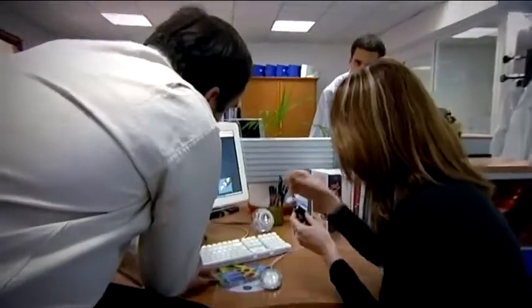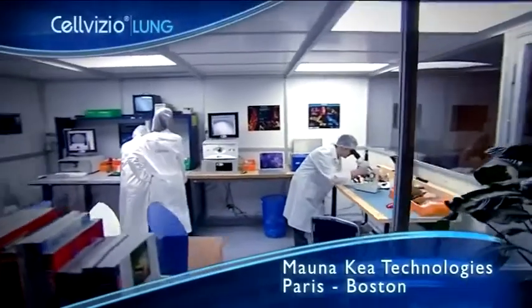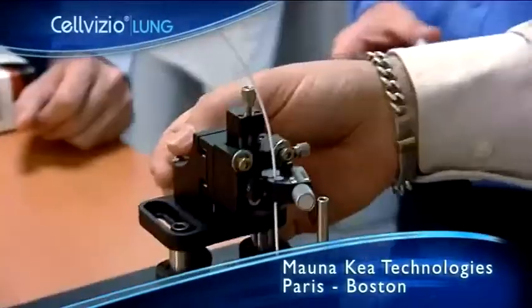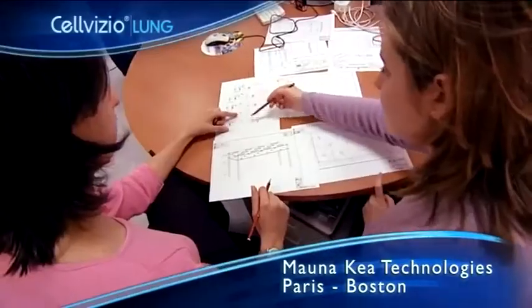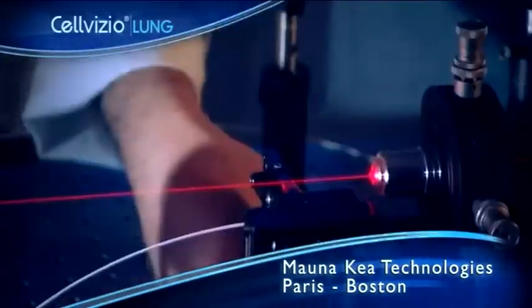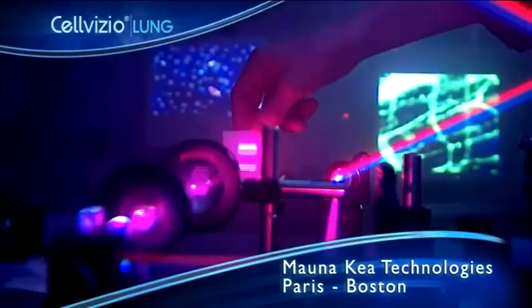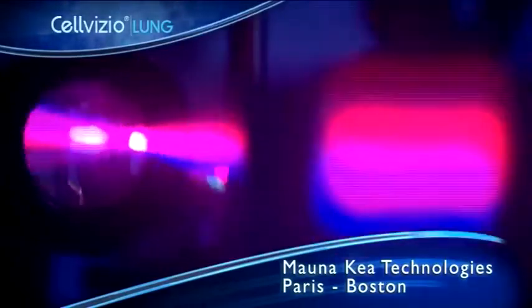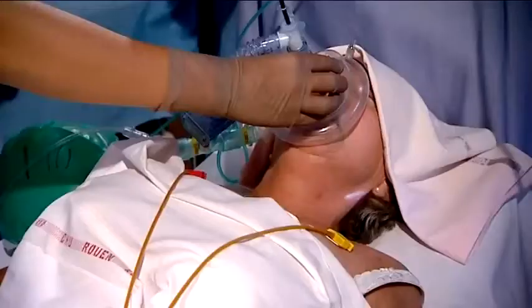Cellvizio Lung is the result of 6 years of research and development by Mauna Kea Technologies in France. A multidisciplinary team of professionals from the fields of biology, medical optics, astrophysics, image processing, and computer engineering work together with a singular objective: to provide clinicians with innovative, minimally invasive imaging devices that improve pulmonary patients' lives in routine procedures.